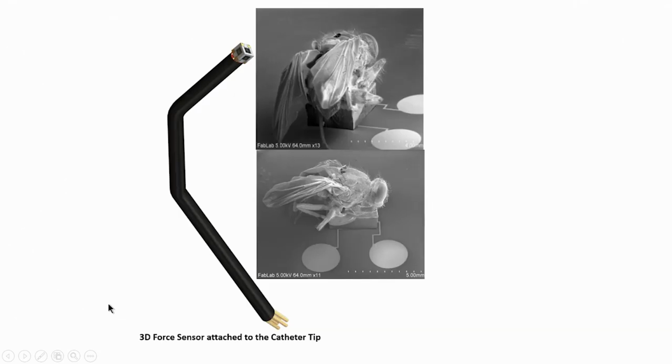Okay. So, in the video you have seen that a surgeon has to insert a catheter in the heart, and then where the catheter is inserted they look at the electrical signal. So, where is the misfiring of the electrical signal, that is called electrical mapping, alright.